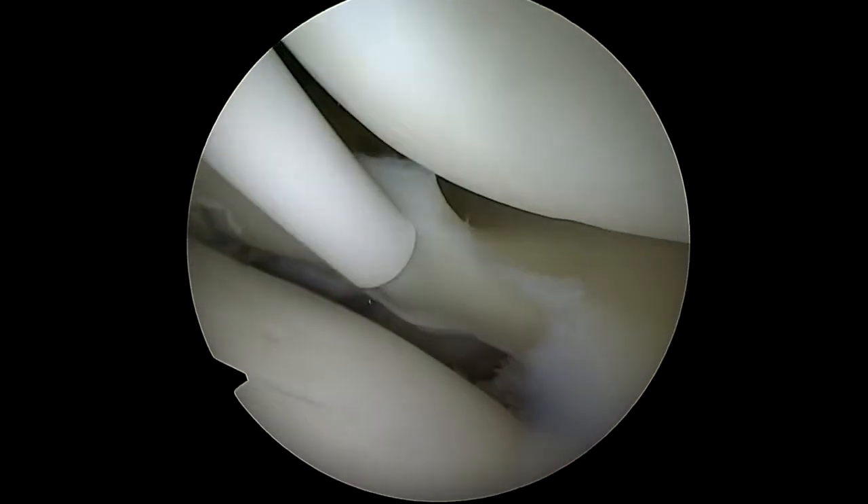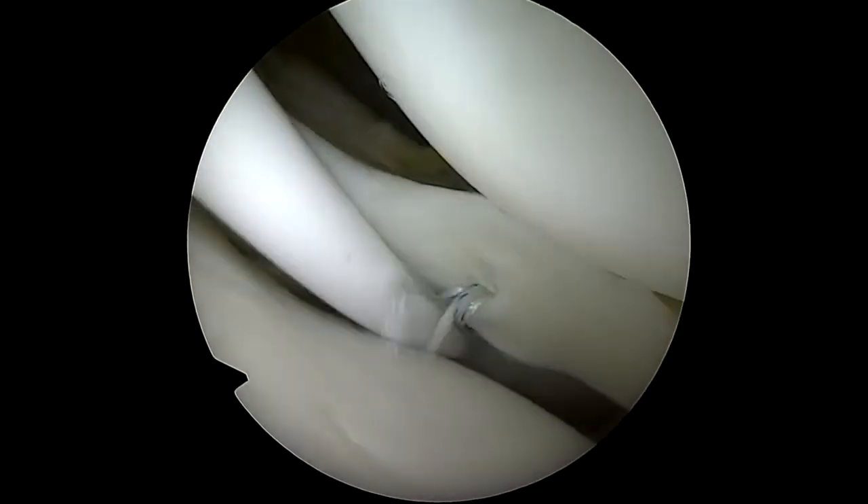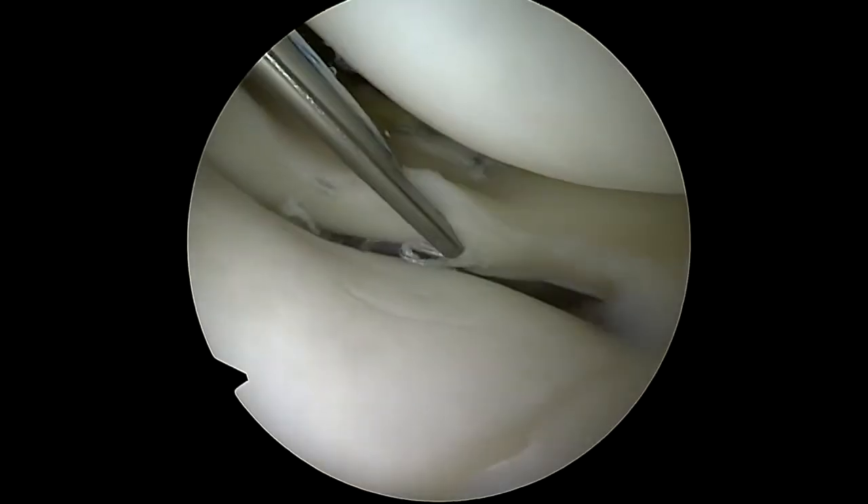A second inferior stitch is then placed in the same manner. Tightening of these inferior stitches allows to close the inferior gap and to compress the lower part of the lesion.